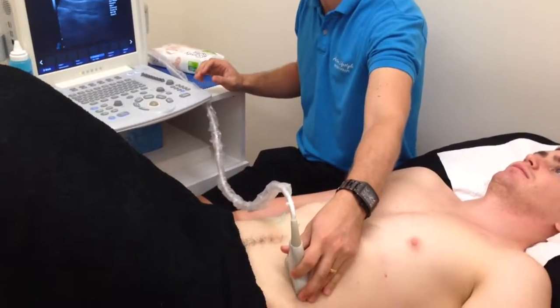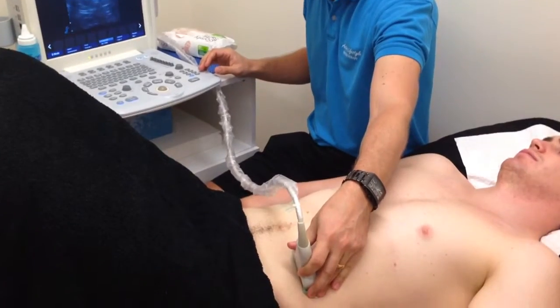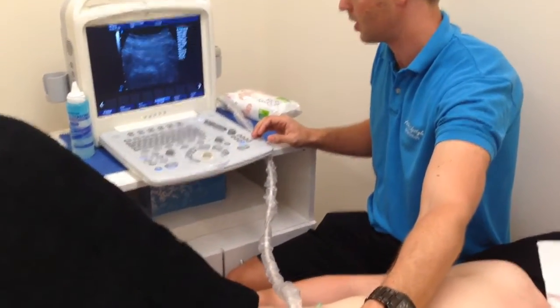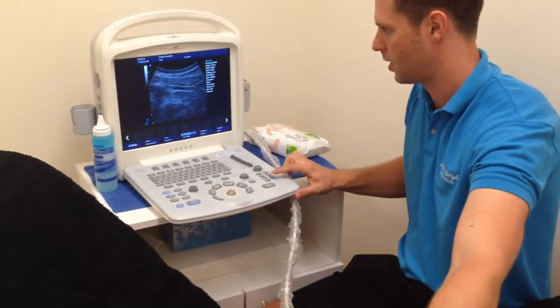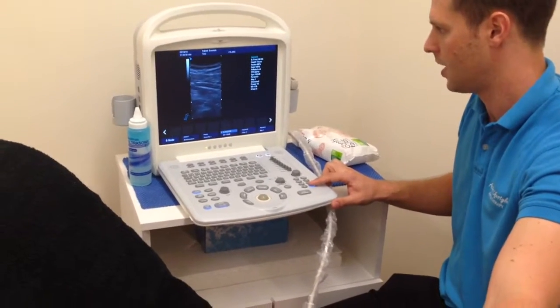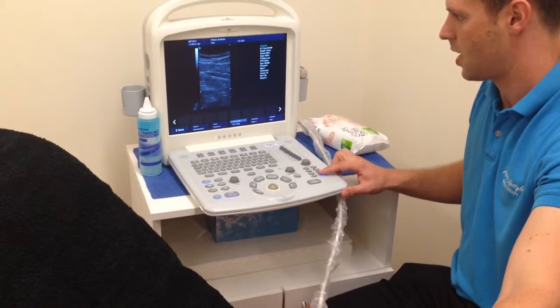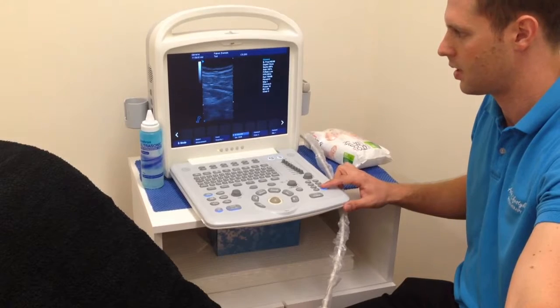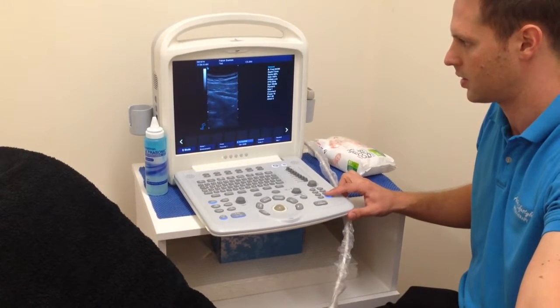What you can use split screen mode for is to compare left side and right side with the transverse abdominus. So if we're here on Ben's left transverse abdominus, we can just hit the VB button, and that's going to give us a snapshot of his left. Just make sure everything's nice and relaxed. It can be quite useful to wait until the end of an exhalation to take your picture, if you want to make sure everything's standardised.